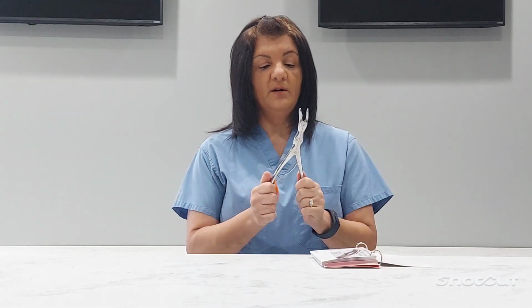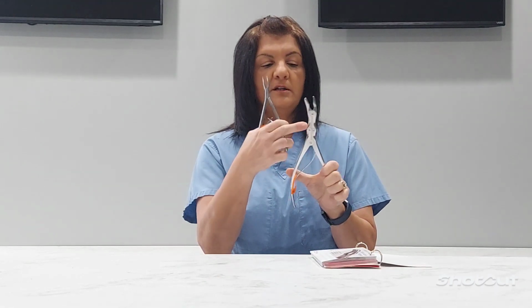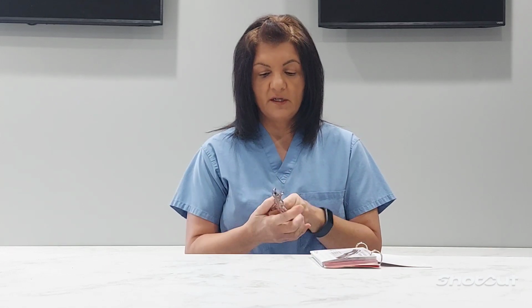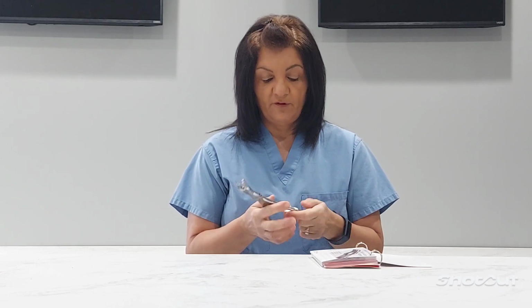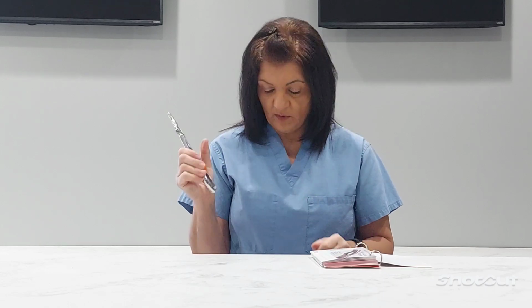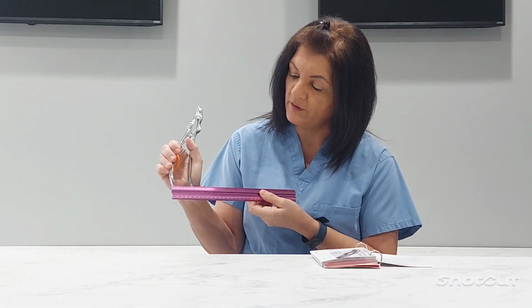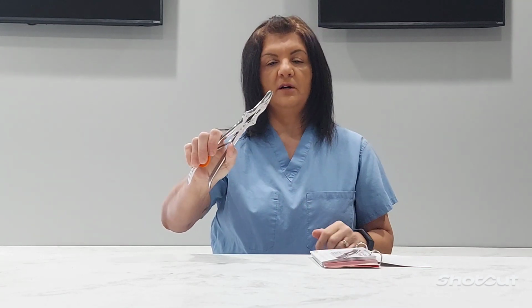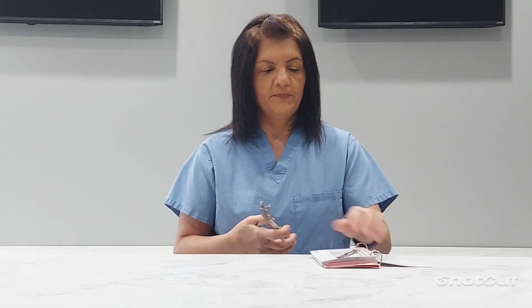The next item we have is a double action rongeur, so you can see the difference between a single action and the joint of the double action. My first thing is I'm looking for pits, cracks, rust, stains. I do see some pits along the line here. Now I'm going to check for function. I'm looking for that rust again along the screws. Now when I squeeze this one, again, this one comes way too close together. It really should be about 2 inches. So when it's actually around 2 inches, again, the teeth don't even come together. This one's beat up pretty good. I see a lot of damage in through here.